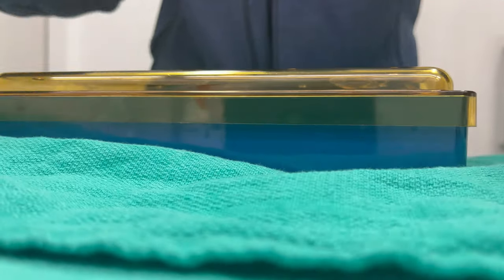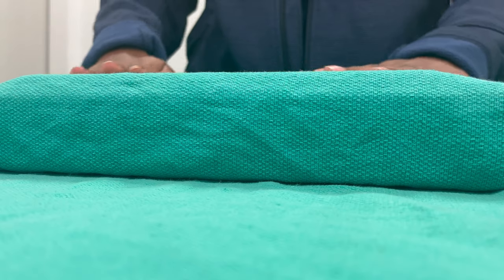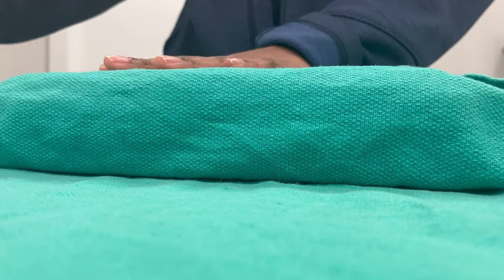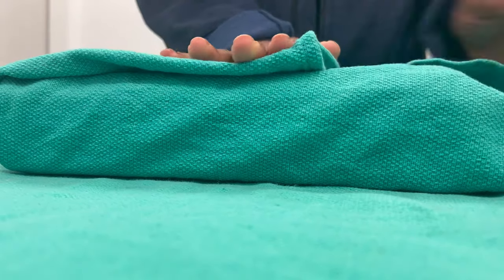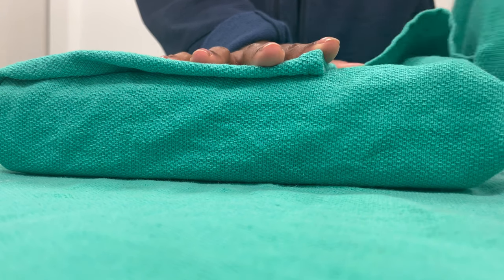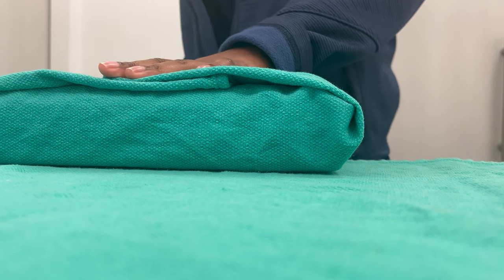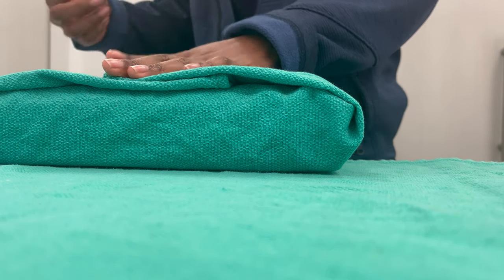And then here's how I wrap the instrument trays. I put it in a towel first. One of the most important things about wrapping instruments is to make sure that there's no air. You want to make it as tight as possible. That's why I put a towel first, to protect the instrument tray. And then I grab one of those blue wrappers.